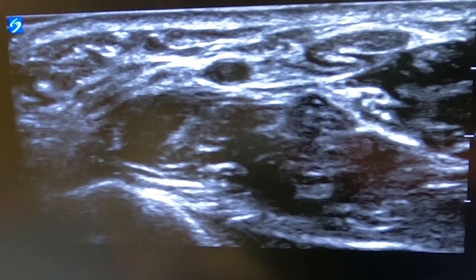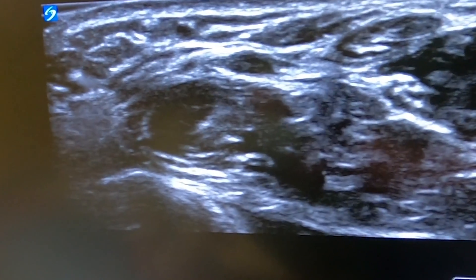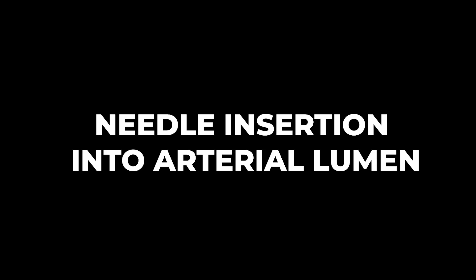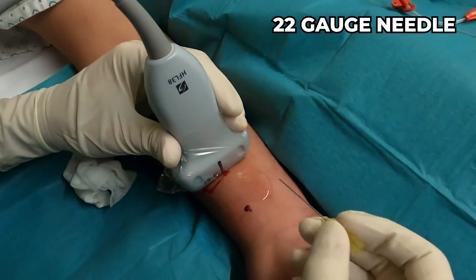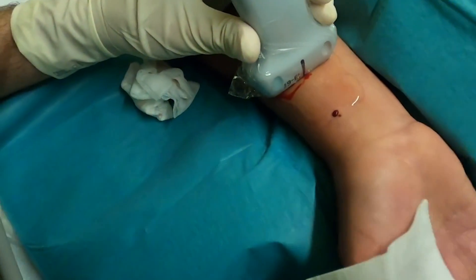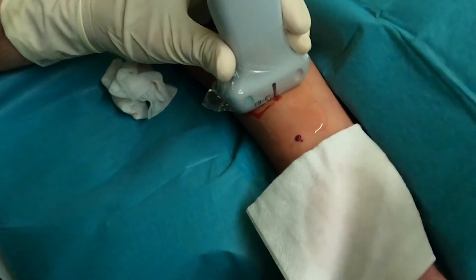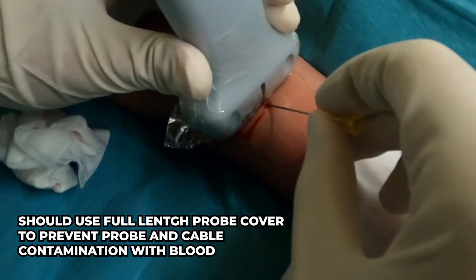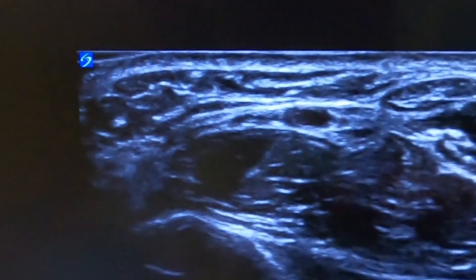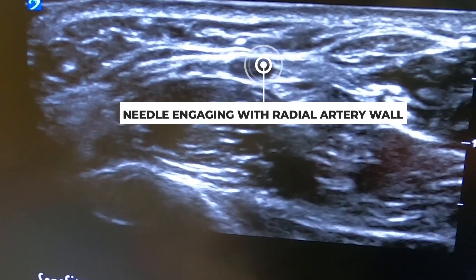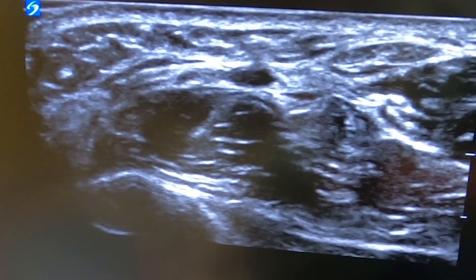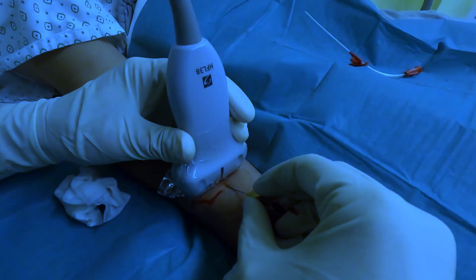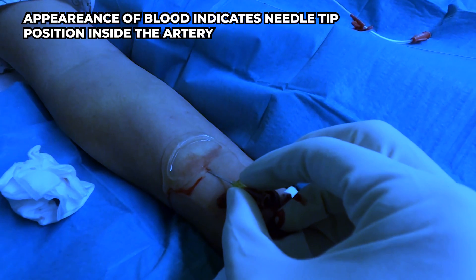Okay, are you ready? Just leave it, let it be. You may want a little bit of gauze so that when you get bleeding flashback you can stop it. It's an out-of-plane technique — let's take a look at it on the other side. You're almost on the artery. Now we want to advance fast to get into the artery — and there we go. We have a flashback.